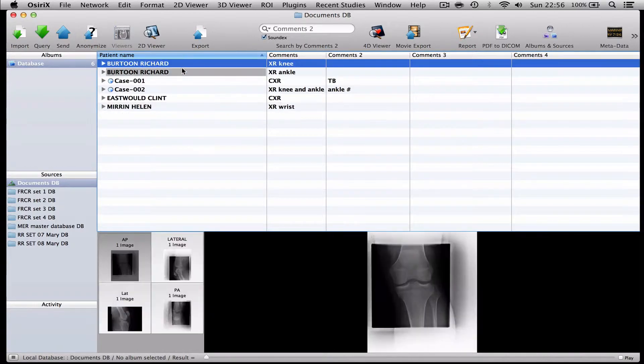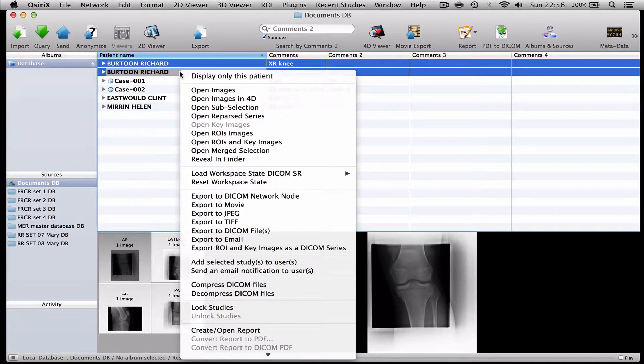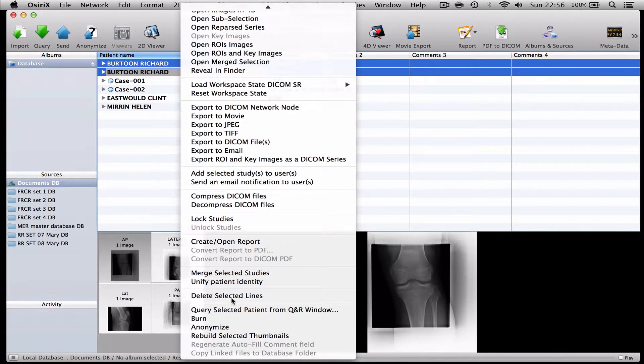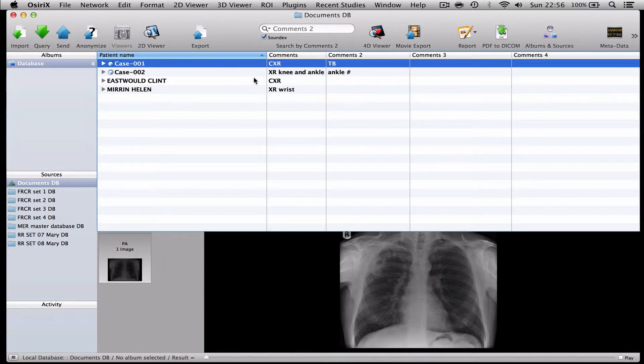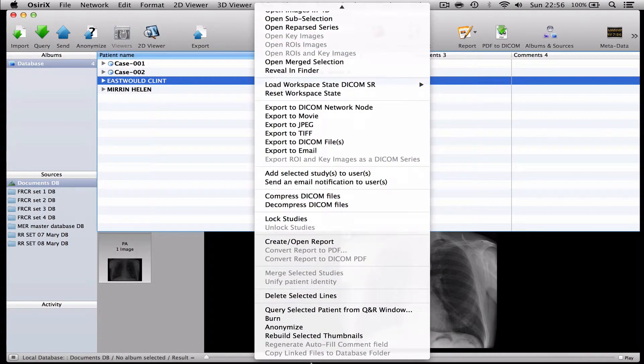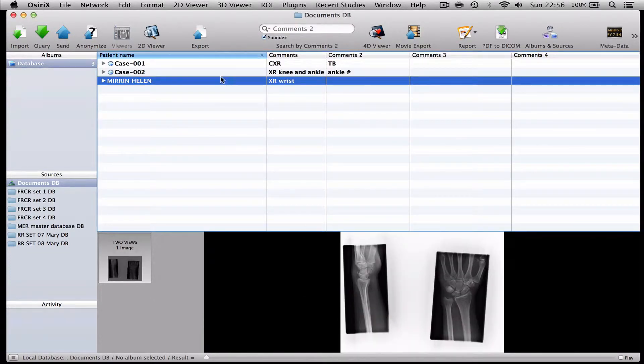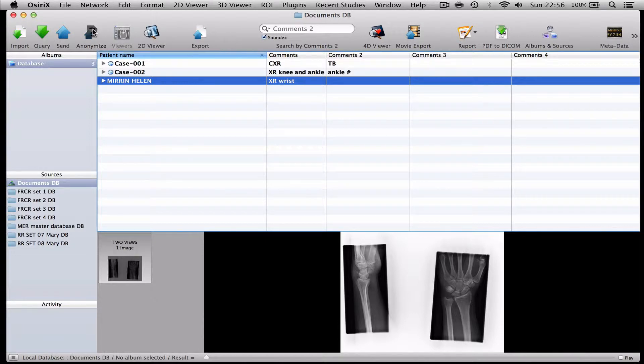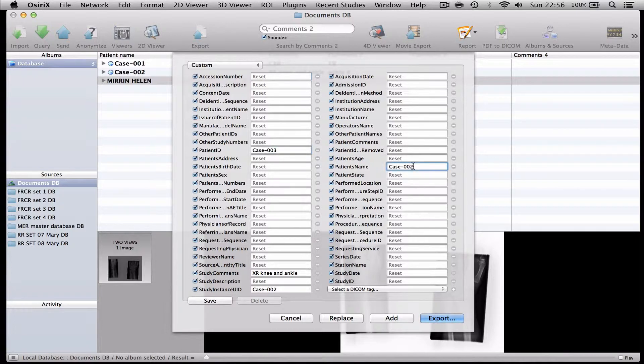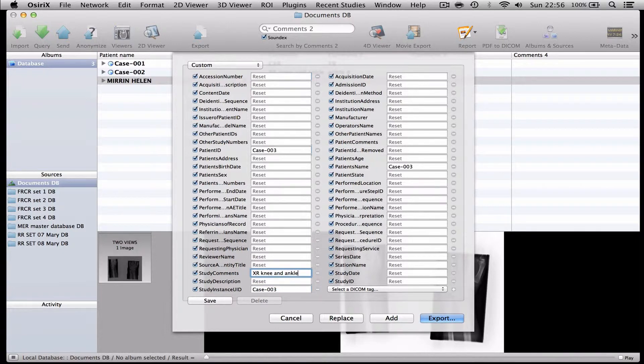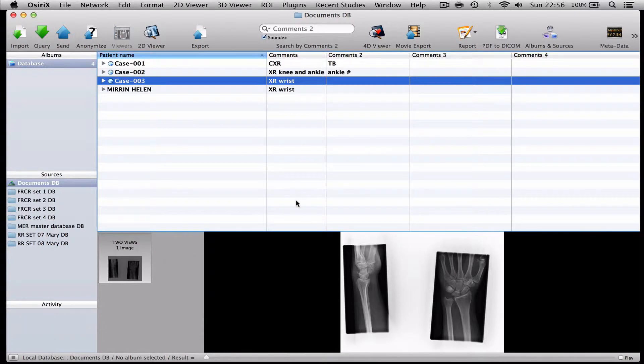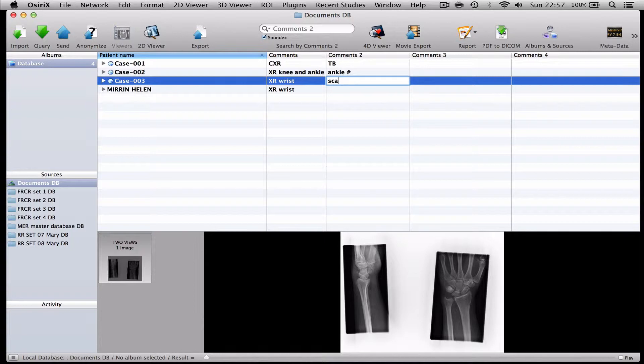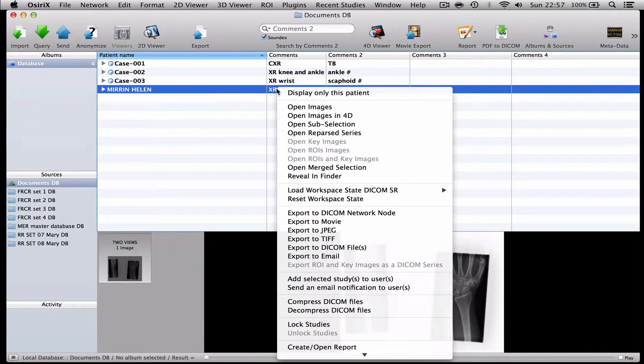And I will now delete the original case. And I'll delete the original chest radiograph as well. And I'm just left with one case which is Helen Mirren, the wrist. And we will do exactly the same thing again. We will call this one case 003. And we will call this X-ray wrist. And we will add it. And we will call this one scaphoid fracture. And we will delete the original.